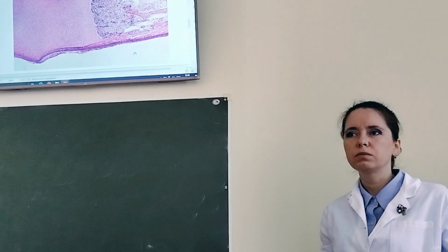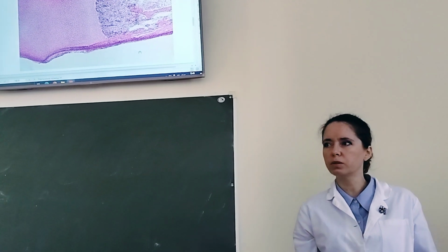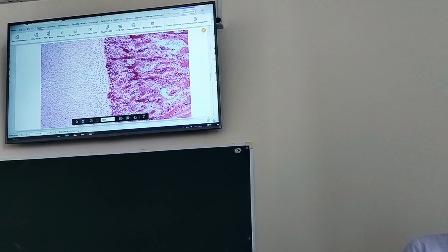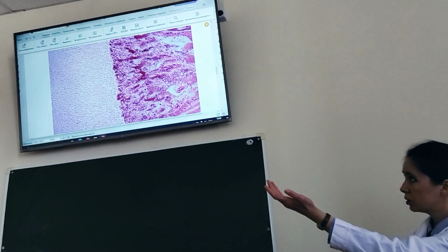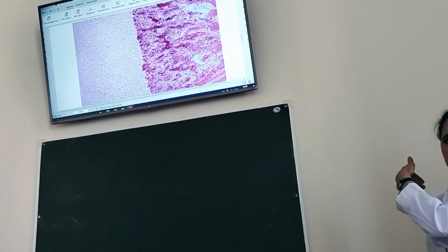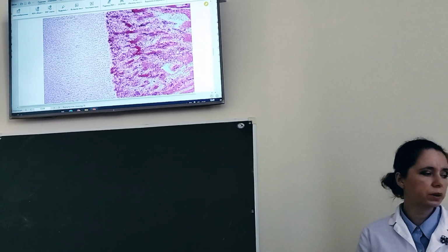Generally, this is enough for explanation, for confirming your decision. And this is again another case, just another variant of indirect ossification. Cartilage replaced by primary bone and an ossification line between them.